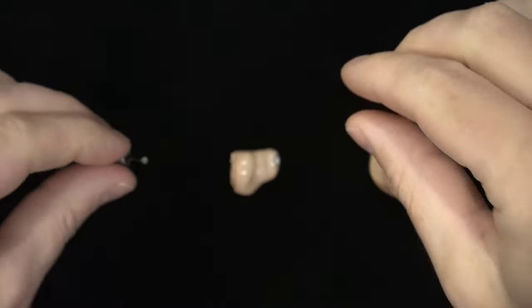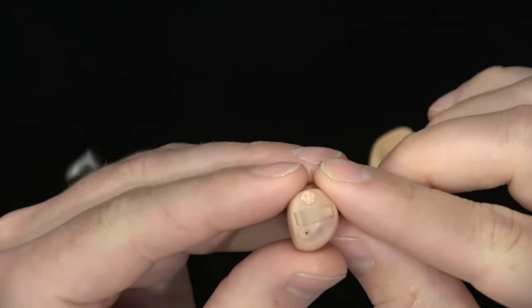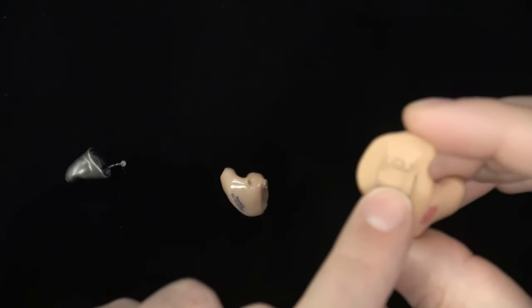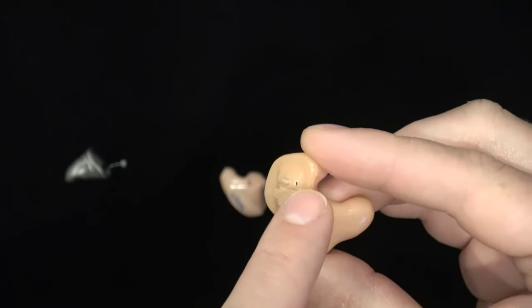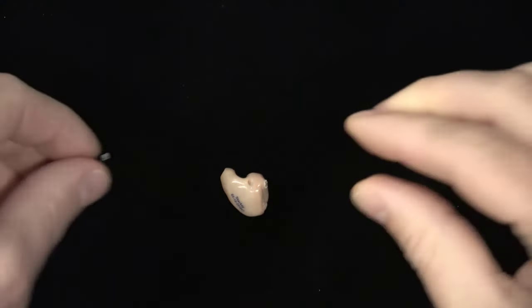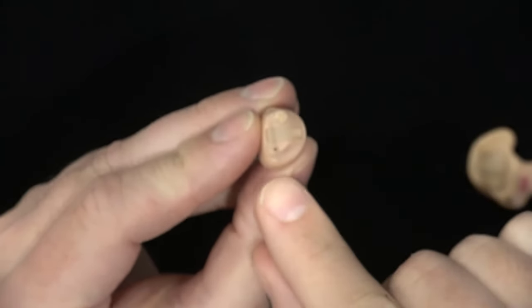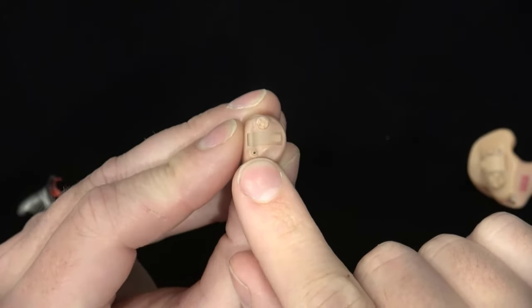On slightly larger custom devices, there is often a mic port on the faceplate, and depending on the size of the hearing aid, there will either be one or two mic ports. Depending on the manufacturer, you might have open ports like the ones we just saw on the RIC and BTE models. You might also have a small non-replaceable filter over the microphone, like in the invisible-in-the-canal hearing aid, but you may also find that there is a microphone filter that looks kind of like a wax guard or wax trap that can actually be removed and replaced periodically.